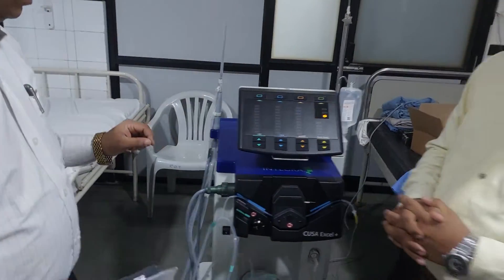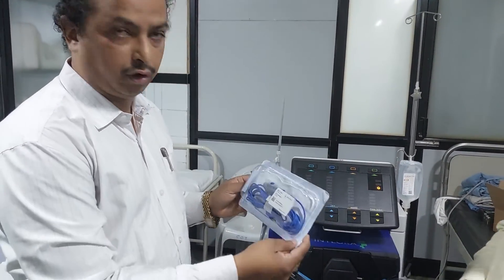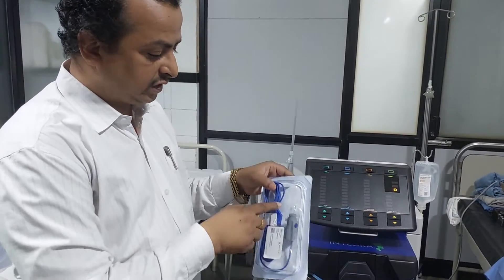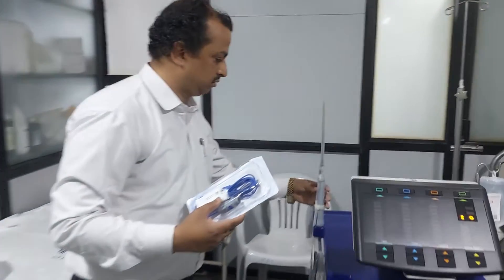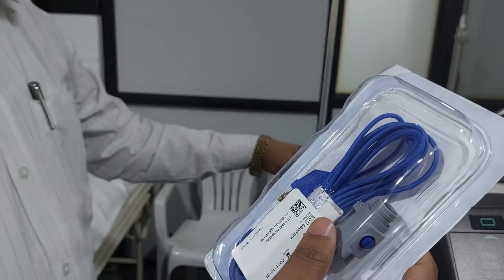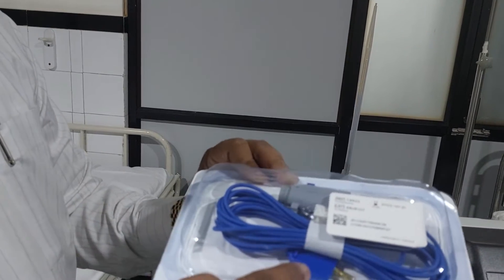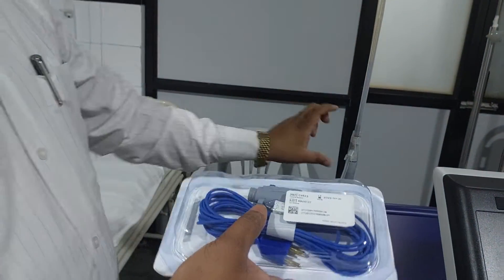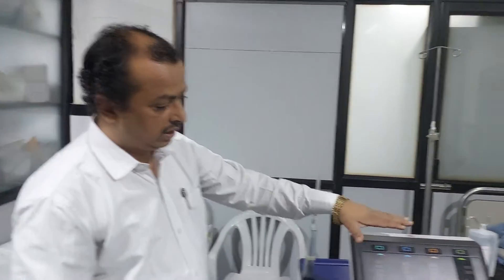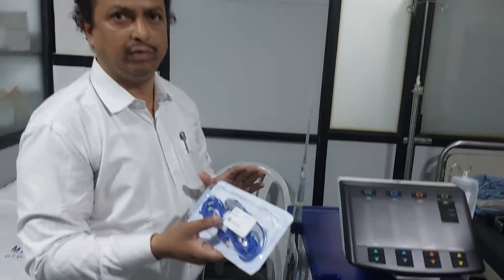If you want coagulation during surgery, they have provided this same nose cone from Integra. You just change this nose cone with the CUSA Electro Module nose cone. This has to be connected to the handpiece and the other end should go to your cautery machine. By connecting this, you can get a coagulation effect during surgery, and all four functions — vibration plus coagulation — will be operative at the same time.